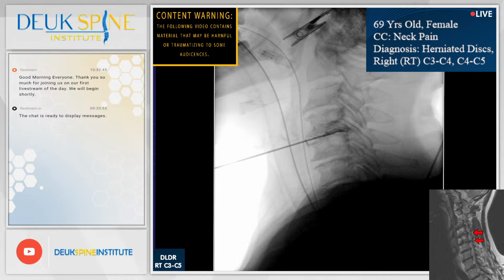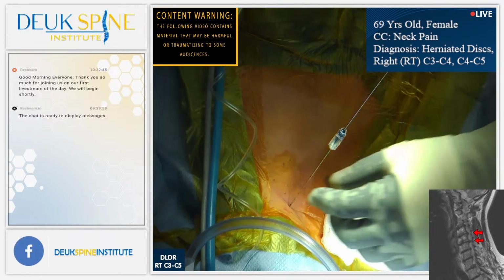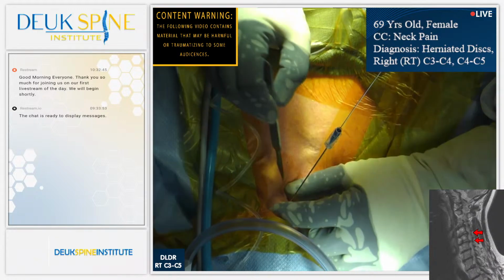If you have questions, feel free to ask them, type them up, and we'll do our best to answer them. Henry is at the helm. He will be relaying your questions to me. In the meantime, we're going to make a 4mm incision. Henry, show the audience how is it that a disc injury can be so painful for patients? What's the mechanism?